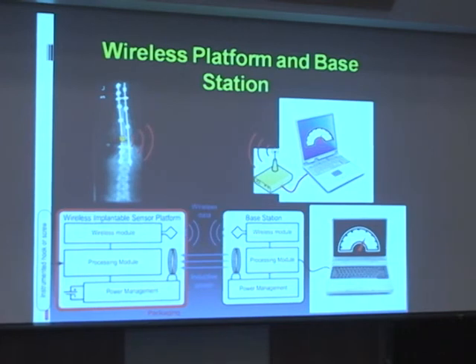This is the design of our system. We have designed a wireless implantable sensor platform. The reason is that we have a lot of other medical applications. So when we build it, we try to build it as a module, so that we have a wireless platform and can attach different sensors for different applications.